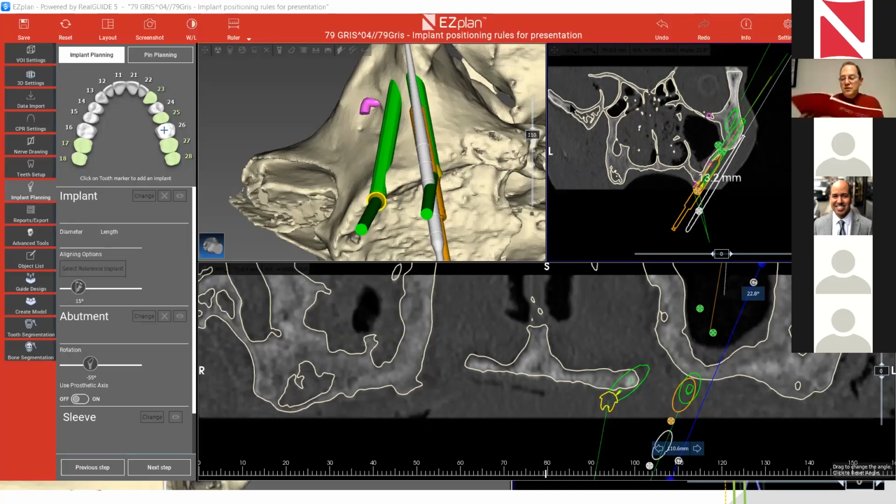It is a two-piece product, but there is no other technical solution for having a correct multi-unit for 50 to 60 degrees going up this much. In this case, it's recommended to use this kind of solution. We'll probably very shortly come out to the market with some more literature explaining this, and they're working very nicely.